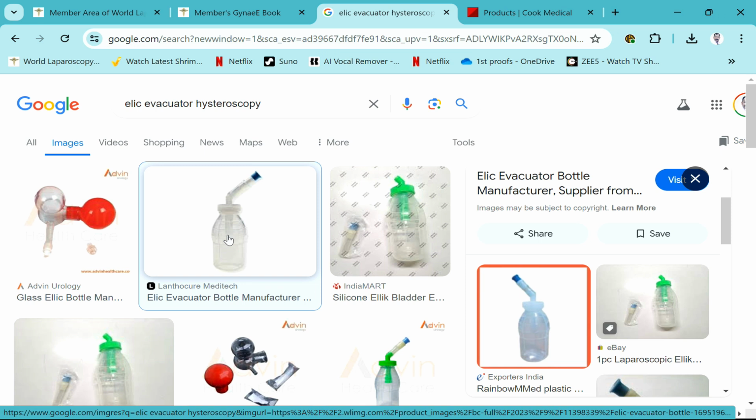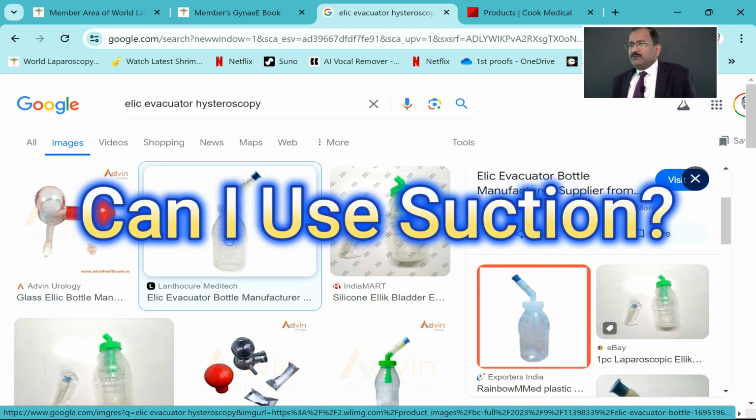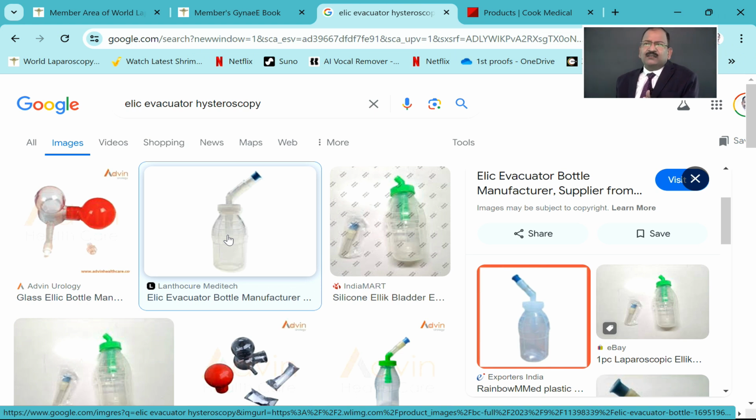So there will be a turbulence of the fluid inside, and that turbulence will clean it. This will also serve for histopathology, the collected tissue; otherwise you don't have a tissue. Suction is not required, it's already compressing. What is the cavity capacity? It is not like the abdominal cavity; as soon as you remove the pressure, automatically everything is ejected out. It wants to come out. You don't need to suck.